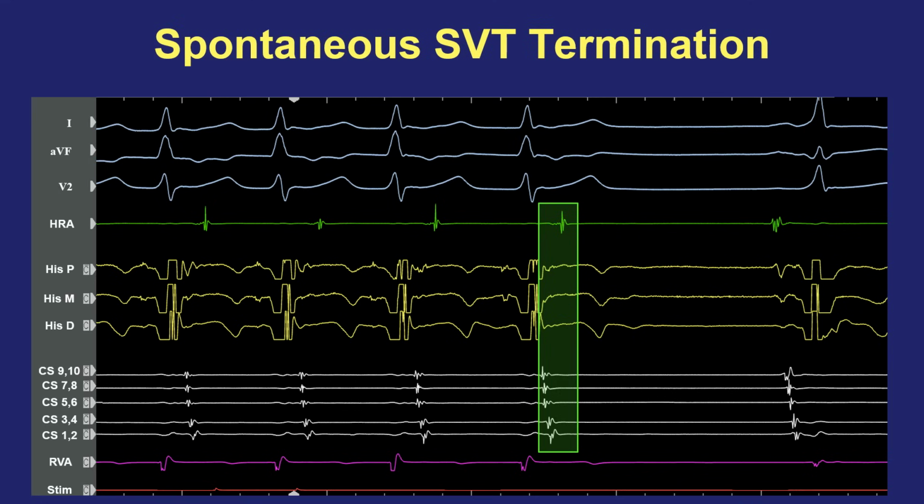If this were an atrial tachycardia, then you'd have this P wave conducting to this QRS and this ATAC beat conducting to this QRS, and then this is the last ATAC beat, and then it stops. But why did this last atrial event not also conduct forward to the ventricles? It comes at exactly the same cycle length as the preceding ones, and there's no reason why, if this spontaneously terminated, that last atrial event would not also conduct down to the ventricles.